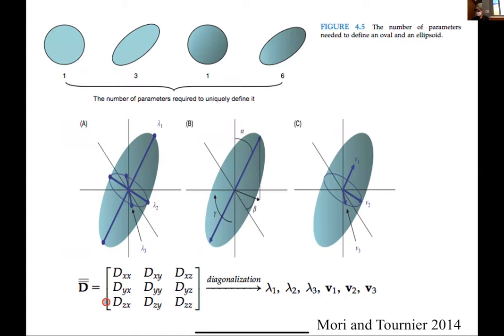You'll hear a lot about people talking about the diffusion tensor. Okay, so in fact, this is called diffusion tensor imaging. And all that means is that we're trying to characterize this 3x3 tensor or matrix in this case. So we're looking at diffusion along the x direction, the y direction, the z direction, and also the xy direction and the xz direction and the yx. And it turns out that matrix is sufficient to characterize an ellipsoid in any direction, okay?